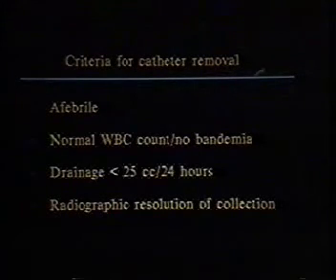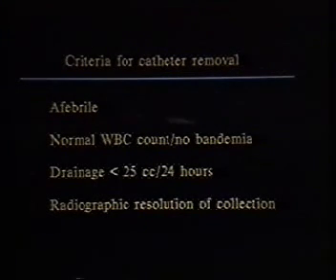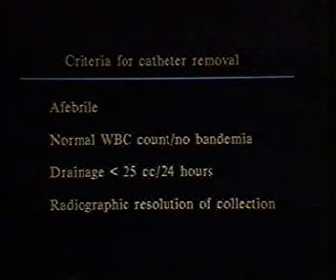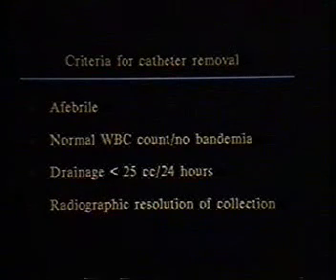The time to remove these catheters is generally when the following things have happened. The patient has defervesced and no longer has any fever, when the white blood cell count has returned to normal and there's no evidence of a leftward shift, when the drainage through the catheter has diminished to approximately less than 25 cc's over a 24-hour period, and when radiography, either chest films or ultrasound or CT or whatever you might want to use, has shown that the fluid collection has resolved.